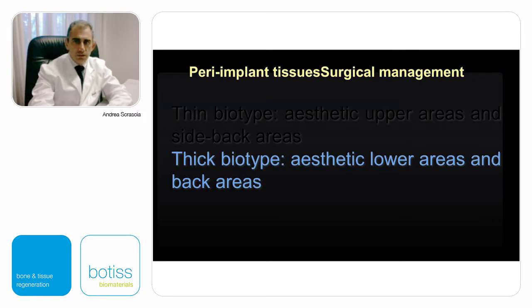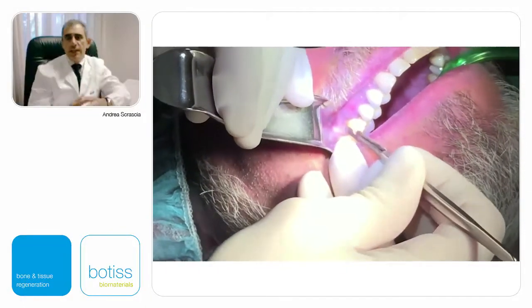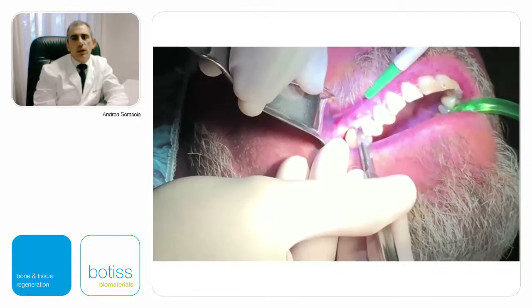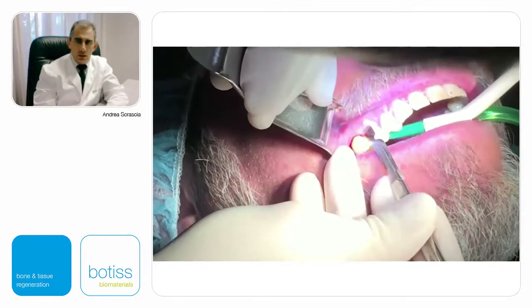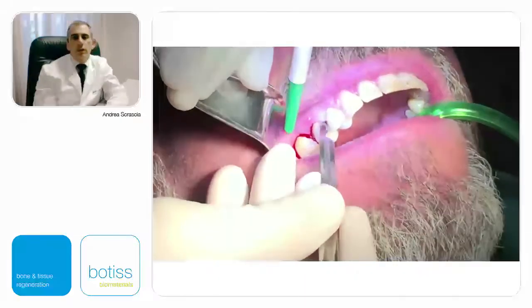In this short video, this is a specific case where I had to execute an extraction of the second premolar on the top right side for an endodontic failure.